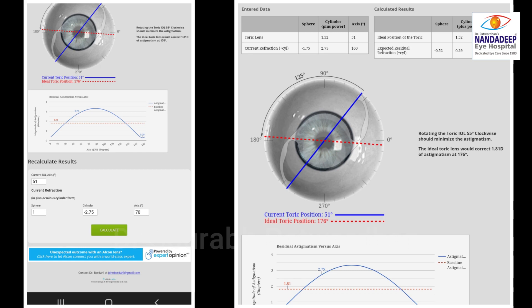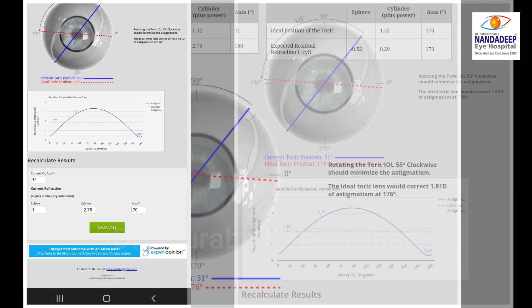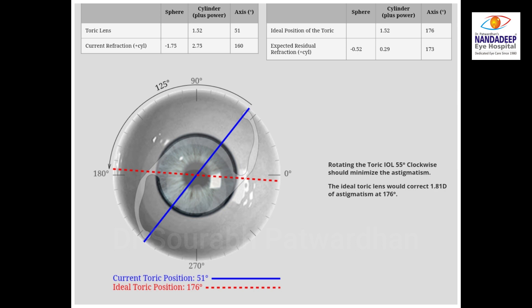So basically the IOL had rotated to 51 degrees from the intended axis of placement. One reason for this rotation can be the large anterior chamber depth and probably a bigger capsular bag in this particular eye.